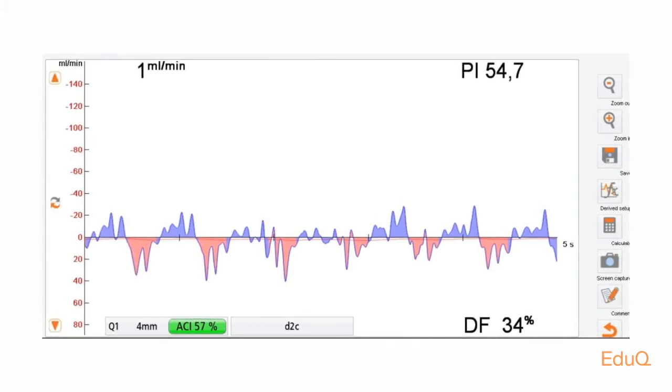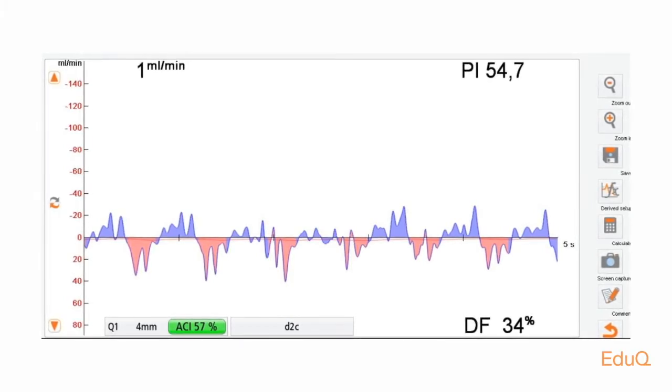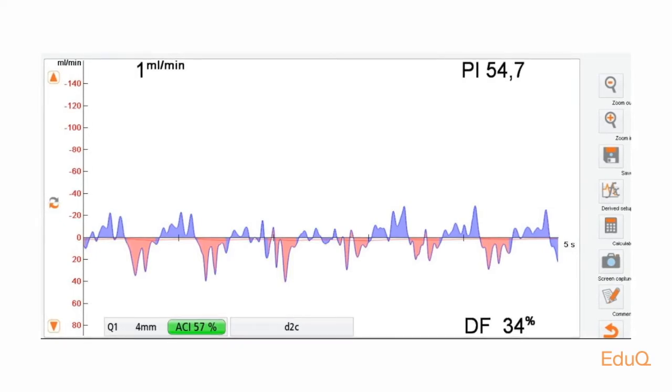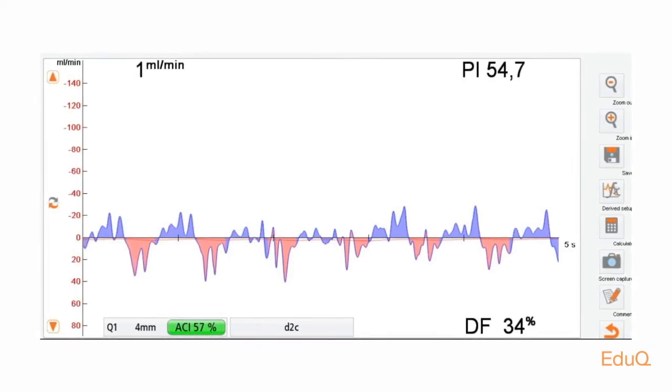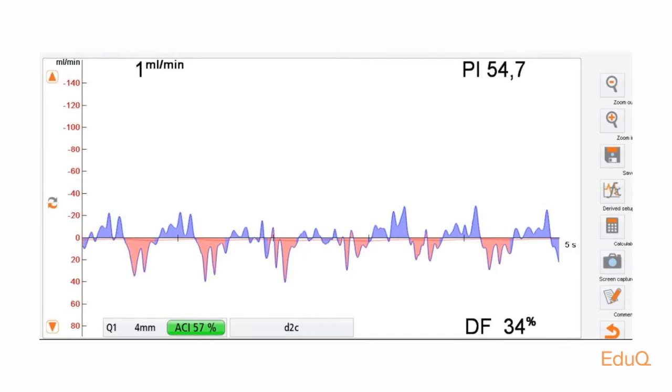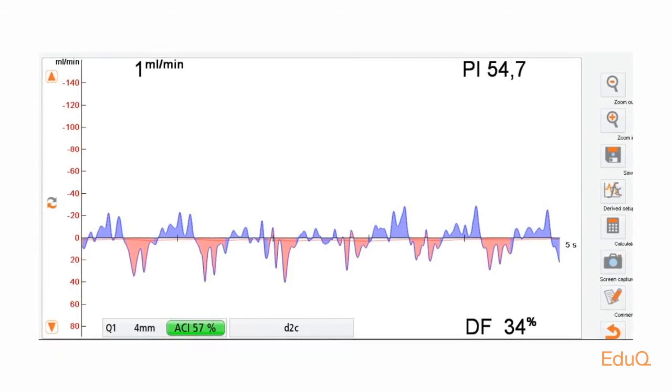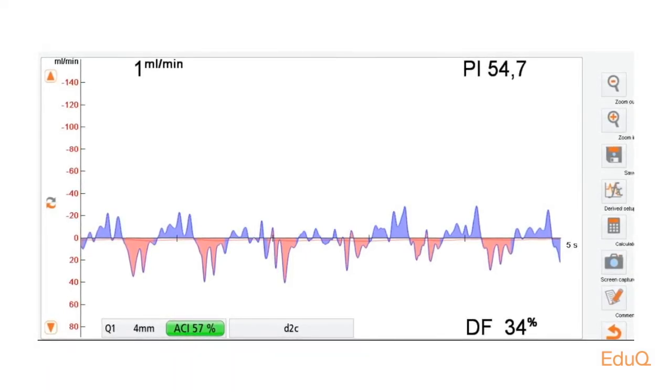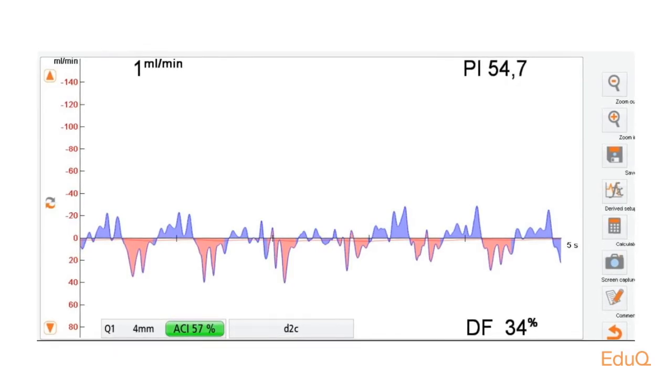The TTFM after the grafting was bad. As you can see, the flow was almost zero and the PI was skyrocketing. You can also see that the curves have a high degree of backflow.